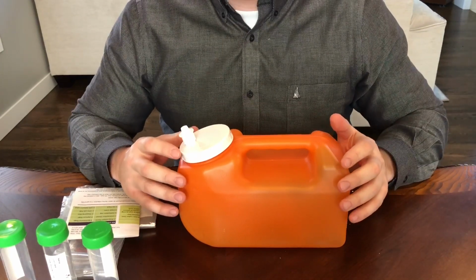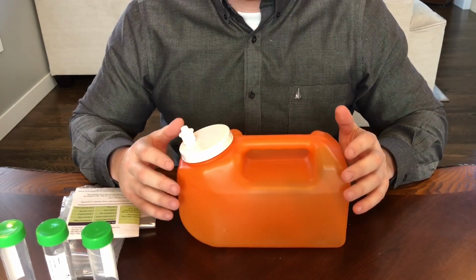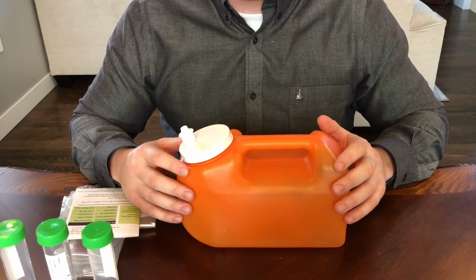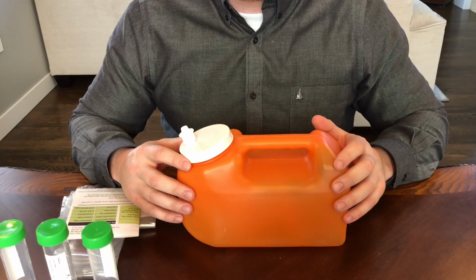At exactly the same previously recorded time the next day of the first void, urinate a final time into the jug. This will end your 24-hour urine collection.